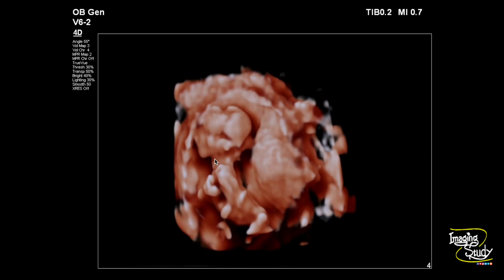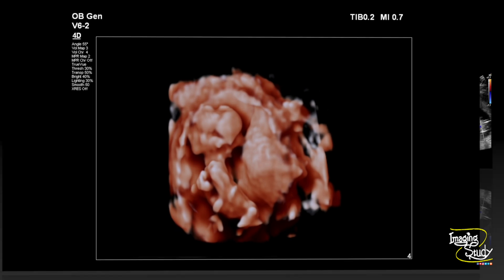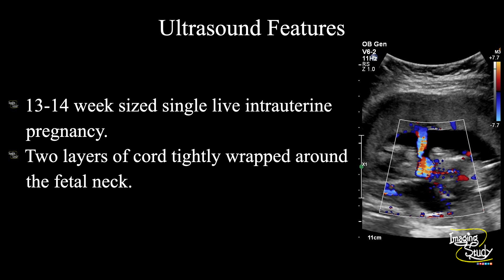Now this is a second trimester pregnancy — what do you think about the prognosis? Can it survive? Tell me in the comment section below. In summary, a 13 to 14 week single live intrauterine pregnancy is seen with an anterior placenta and adequate amniotic fluid. There are two layers of cord tightly wrapped around the fetal neck, placing the fetus in a hanging position.